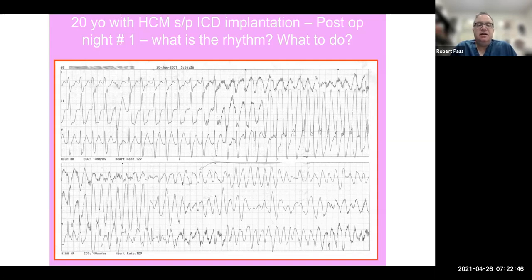So the idea of putting in a Medtronic lead, like a Medtronic ICD lead, and attaching it to this now brand new ICD, that was a pain in the neck, because you would then have to create this extra bulk in the pocket because of all of these adapters, which of course probably were a mechanism for weakening the lead as well. And so basically what we did in this case was we put a dedicated rate sensing lead in this patient. So she had two leads.